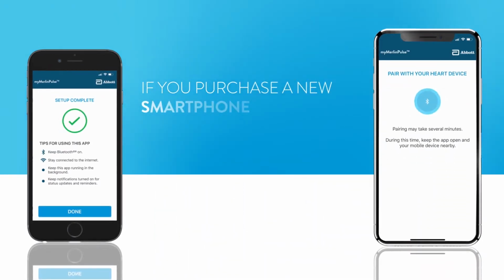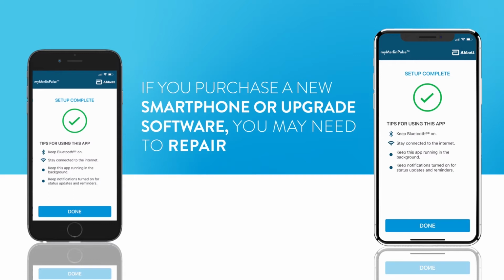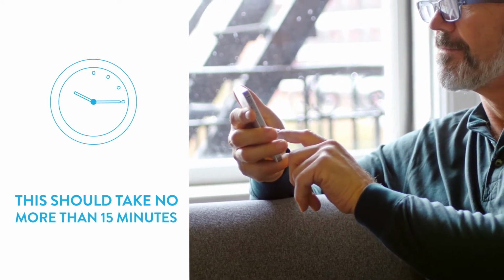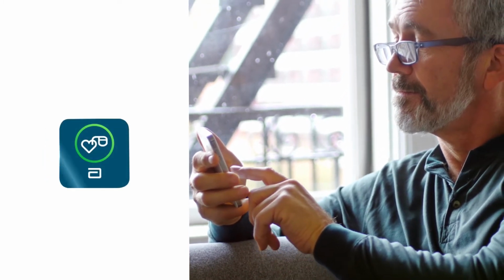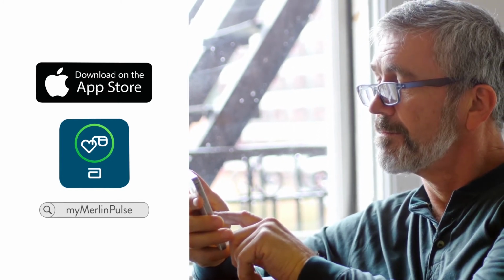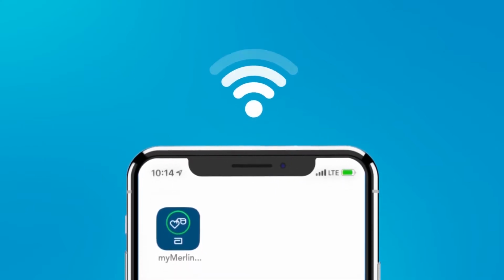However, if you purchase a new replacement smartphone or upgrade the software on your current smartphone, you may need to repair your device. This should take no more than 15 minutes to complete. Before we walk through how to pair your device, you will need to have the myMerlinPulse app downloaded on your iPhone. If you haven't downloaded the app yet, visit the App Store and search for myMerlinPulse to locate and download it. You'll also want to ensure you have a good internet connection before you begin pairing.